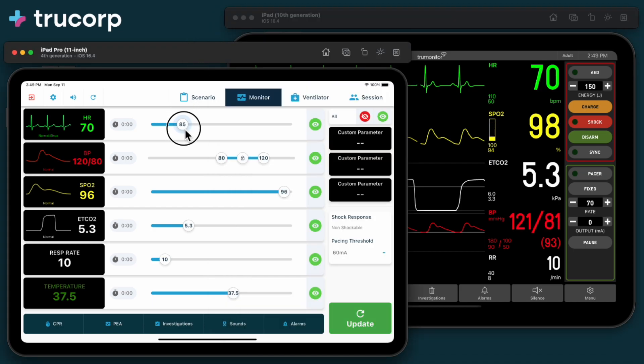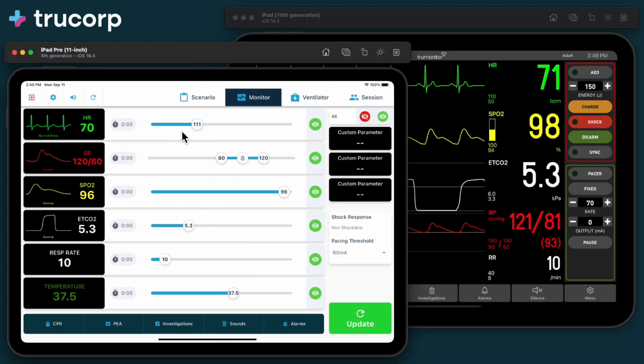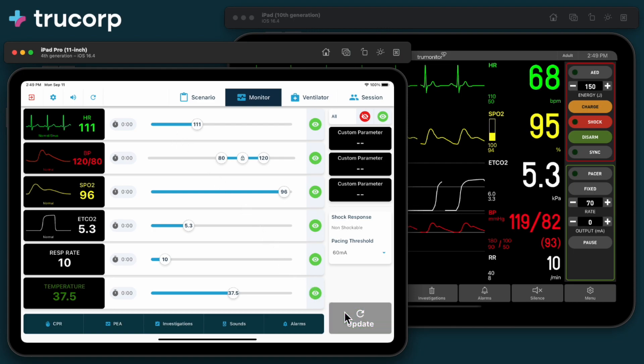Use the sliders to adjust heart rate and other values. Changes are not sent to the student until you press the green update button.